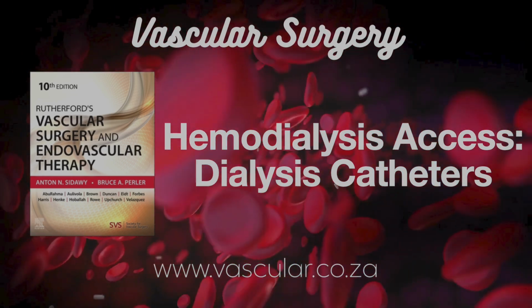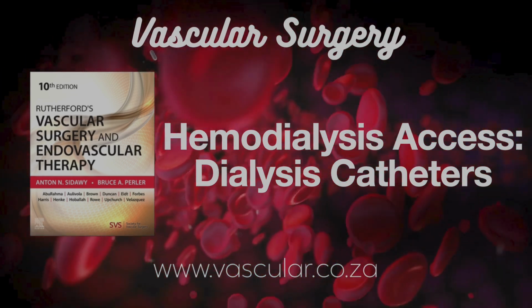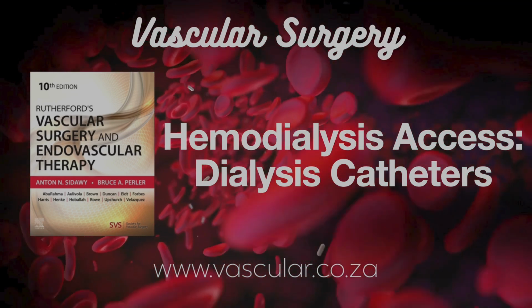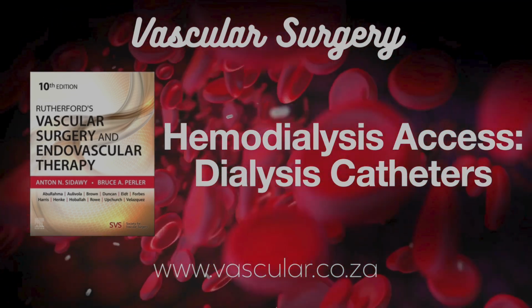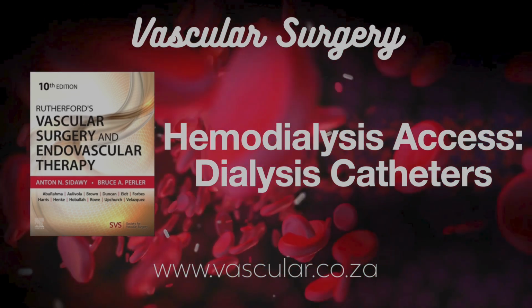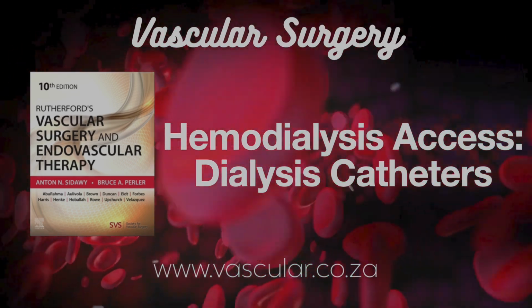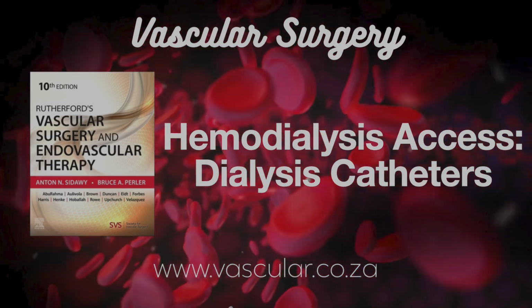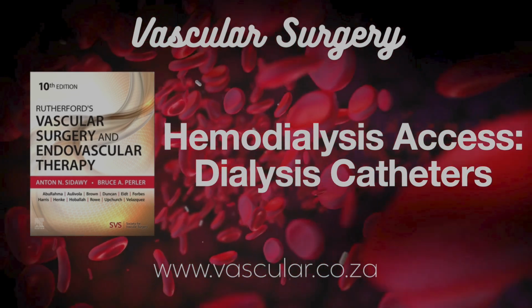Highly individualized. Options range from guide wire exchange, removal, and delayed replacement, trying to salvage with antibiotics and maybe antibiotic locks instilled in the catheter, especially if it's the last access. What bugs are common? Mostly gram-positives. Staph aureus is a big one. Start with broad antibiotics, then tailor to the culture results. Fungal infections need specific antifungals.